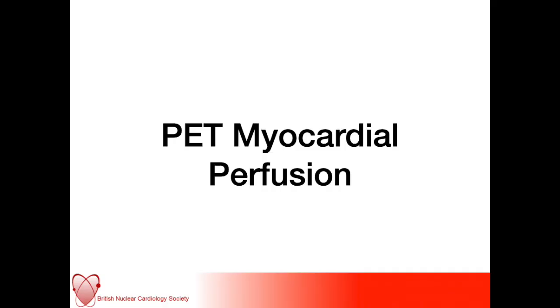So there are imaging considerations and some practical considerations, but this is why you may request a thallium scan and you actually might get back a MIBI scan or a rubidium scan. These tracers have been largely shown to be equivalent, and there are inherent superiorities with the PET tracers over the SPECT tracers.